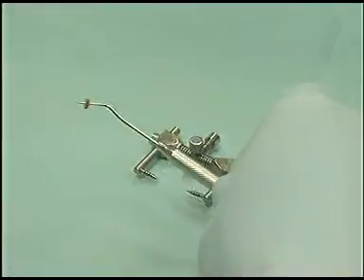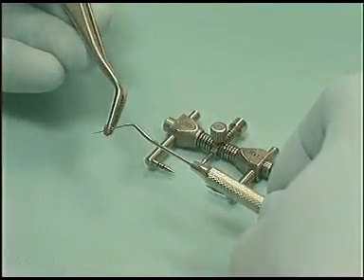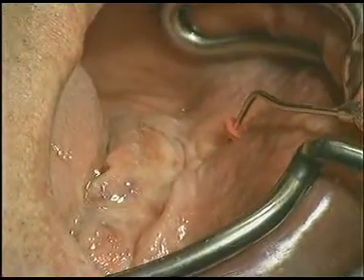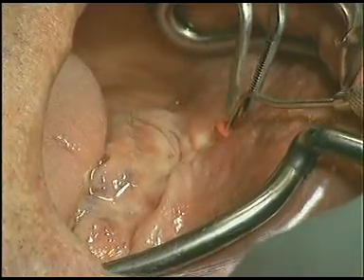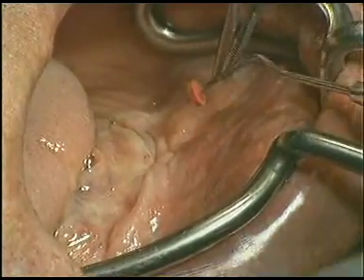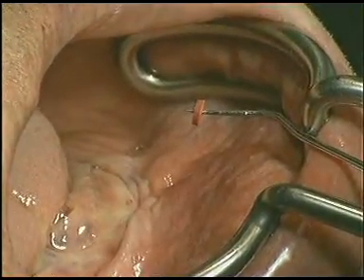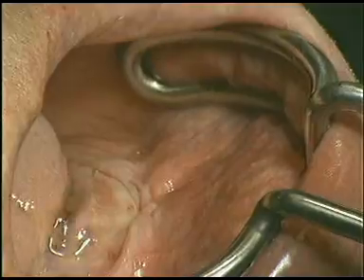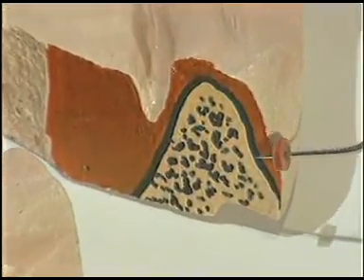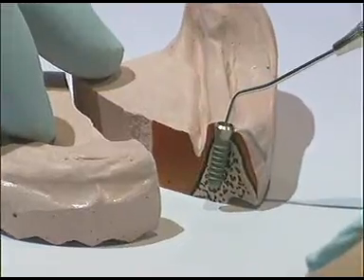Once the mucosa have been anesthetized, the thickness is best measured using a dental probe with a sliding silicone stop on its tip. The bony alveolar process can be probed at several spots, and the thickness transferred to a section model to map the bone and produce a reliable cross-section showing the width of the jaw. These figures can be used to predict the implant diameter and axis accurately in advance.